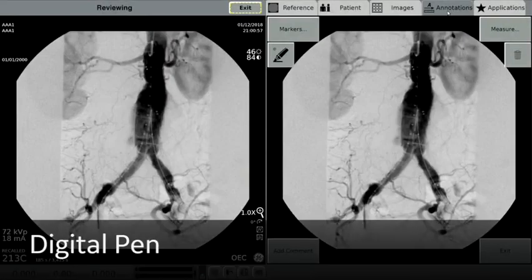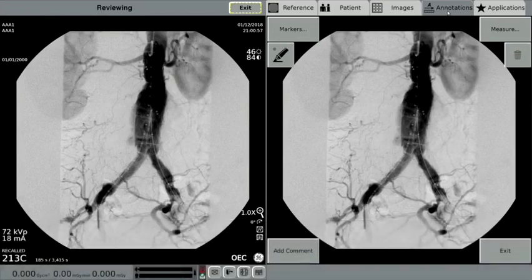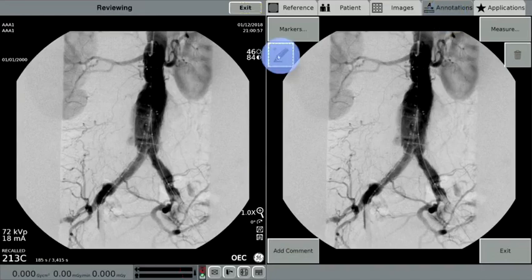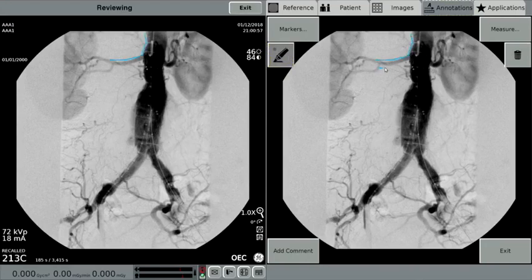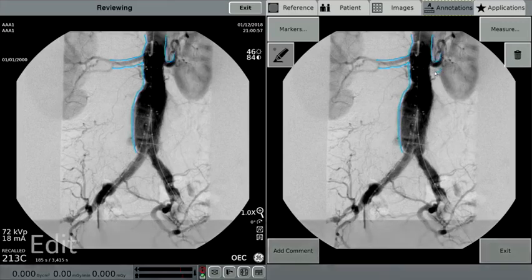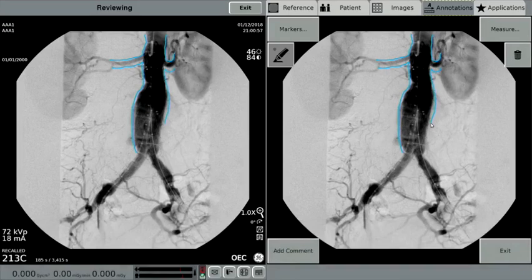Digital Pen is a feature of the OEC Elite CFD Premium C-Arm designed to outline areas of interest on the image screen. To use the Digital Pen feature, select the Annotations tab and then the icon with the pen on the left. With a stylus or sterile finger, a user can draw outlines of renal arteries from the aorta. This could aid in the ability to identify if an aortic stent placement is compromising blood flow to the renal arteries.